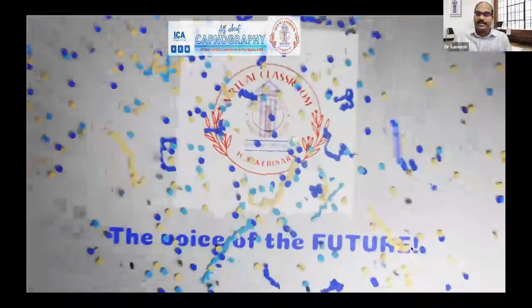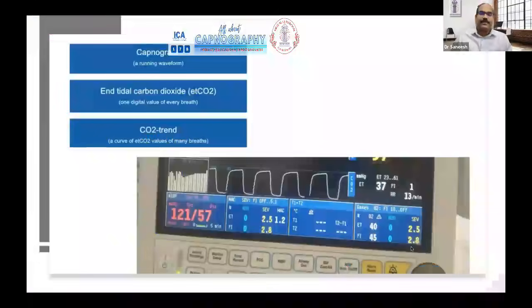So now we are doing the interactive part. As Dr. Deepak has mentioned, before you try to interpret EtCO2 or capnogram tracing, we need to look into three things: the capnogram, a running waveform, the end-tidal CO2, and the CO2 trend.